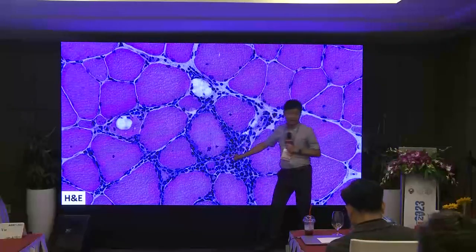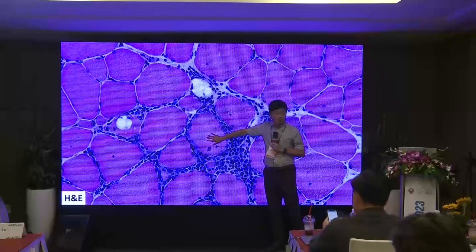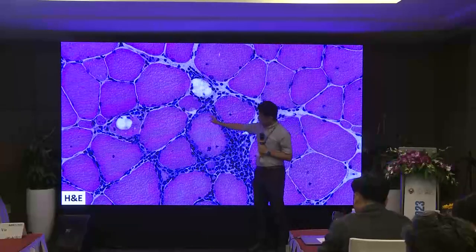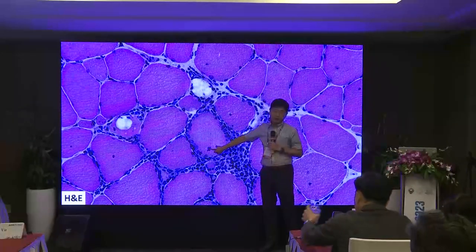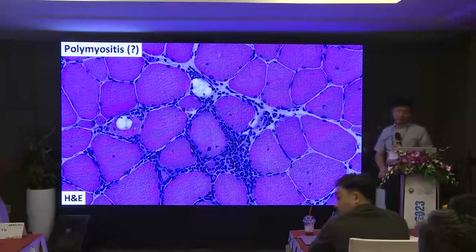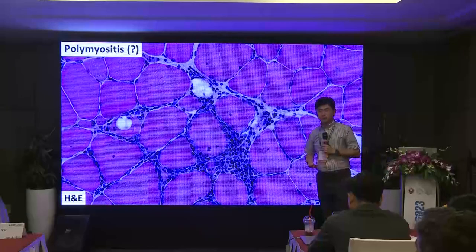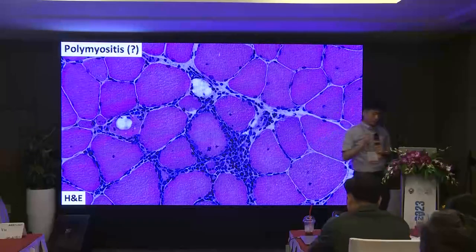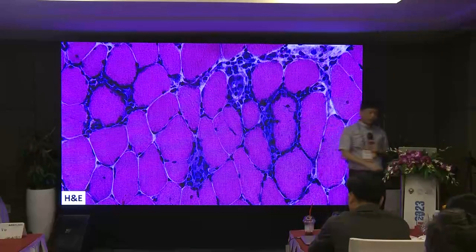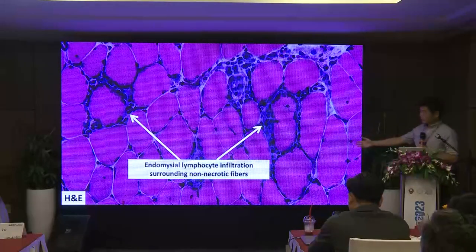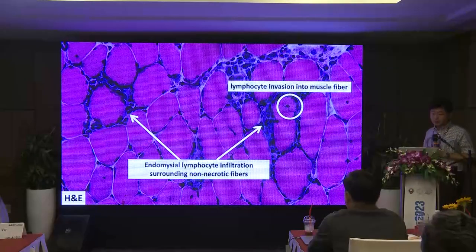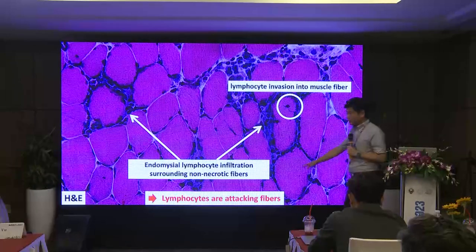However, this is different: lymphocytes are in the endomysium surrounding non-necrotic fibers — and you can even see invasion into non-necrotic fibers. This is like a peaceful residential area where your house is surrounded by lymphocytes with bad intention. Endomysial lymphocyte infiltration surrounding non-necrotic fibers and invasion into non-necrotic fibers — this is the current pathological definition of polymyositis. It means that lymphocytes are actively attacking muscle fibers.